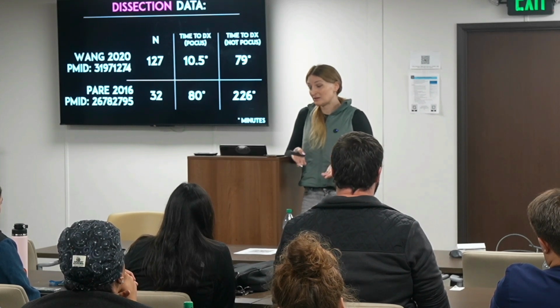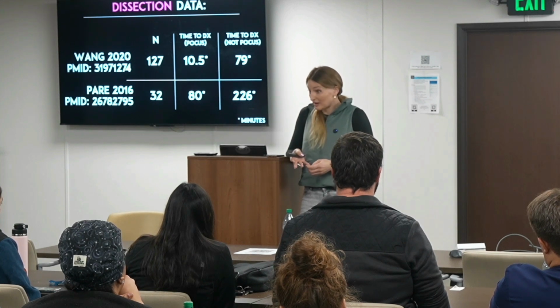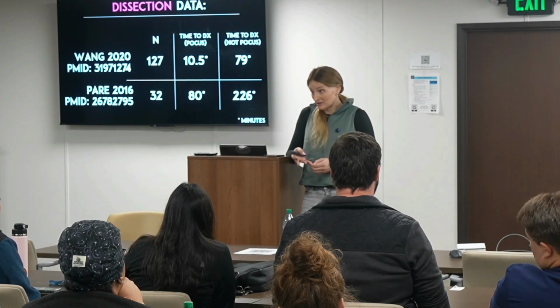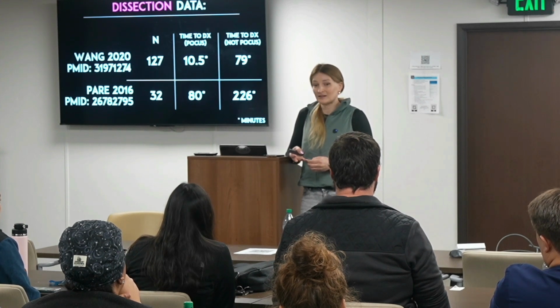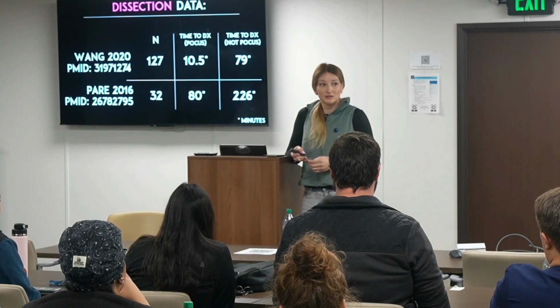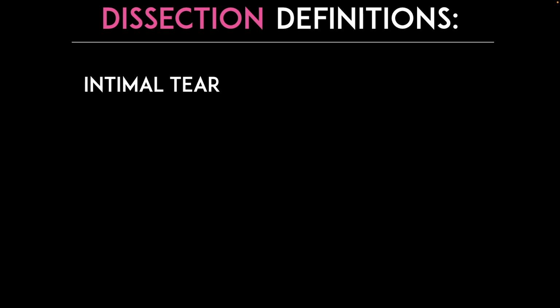So there's a lot of issues, and we diagnosed her really fast because I actually used the butterfly. She was on a stretcher, just because stroke patients don't have pain. You know, they're not hurty. There's a weird, very rare thalamic stroke that can have some pain, but this is why ultrasound is beneficial.